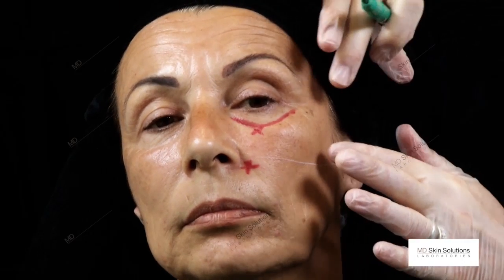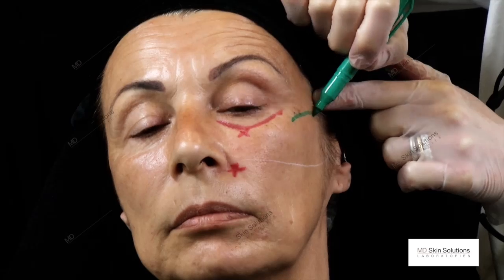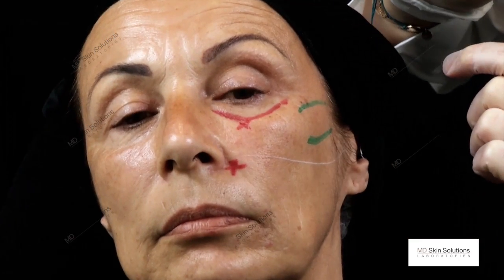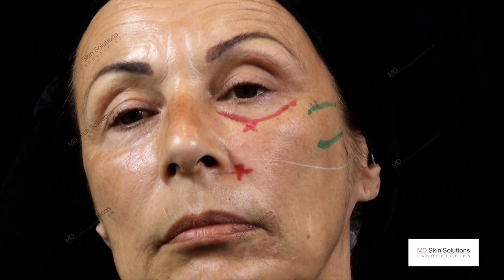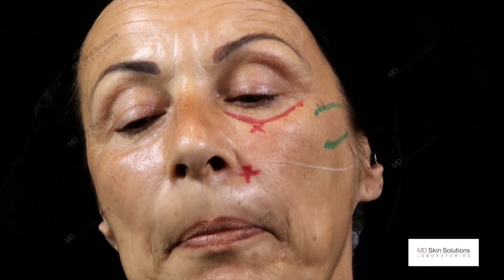The first entry point is defined by the upper and the lower zygoma. The entry point is chosen according to the equipment I use. So in this case, a blunt tipped cannula.